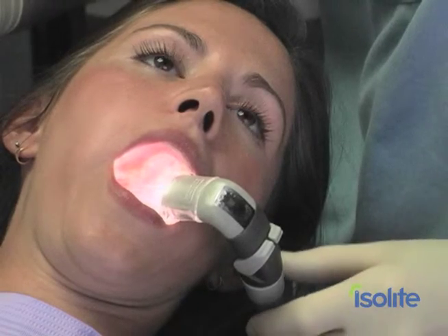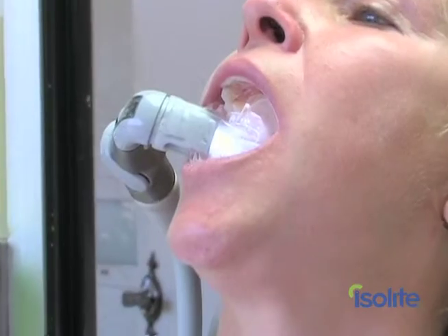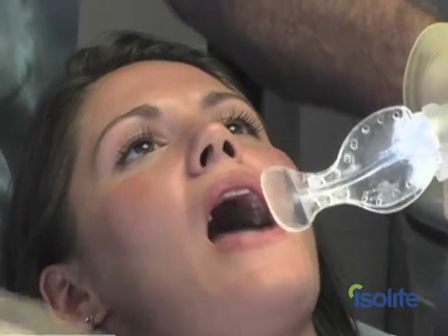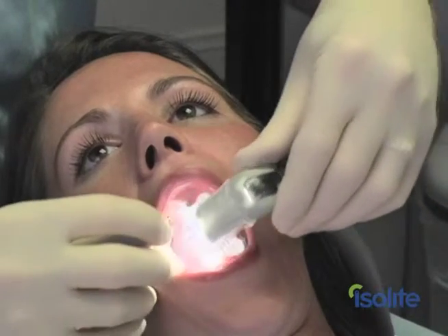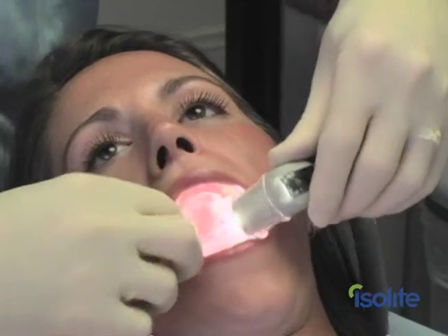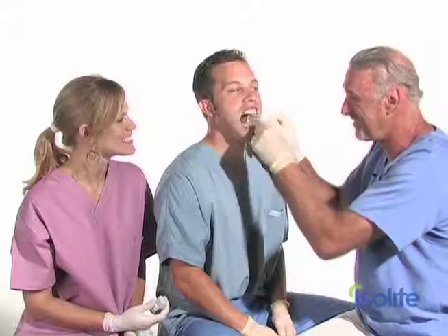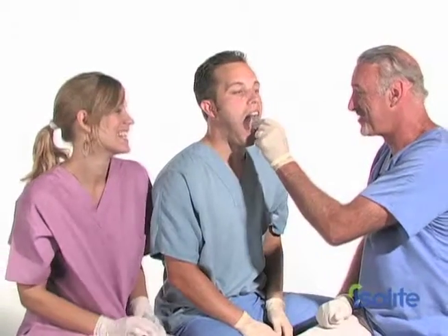It's that easy. If you find you need additional vertical or lateral working room, move the bite block distally onto the first molar. Here are a couple of tips for placement to remember: One, always insert the mouthpiece towards the cheek area first to avoid touching gag-sensitive areas. Two, practice the steps shown until you can place the mouthpiece in one fluid motion. And most importantly, practice mouthpiece placement on yourself and on your practice team prior to trying it on your patients. It will probably take you less than half an hour of practice time and you'll be a pro.